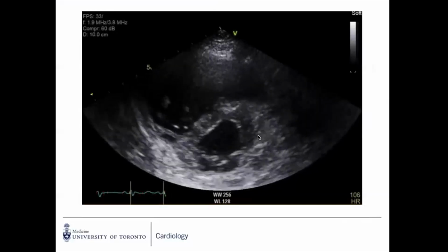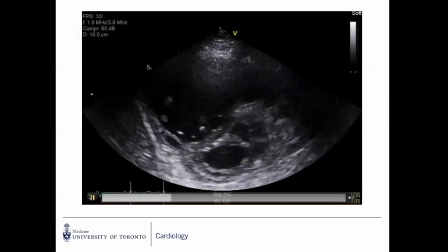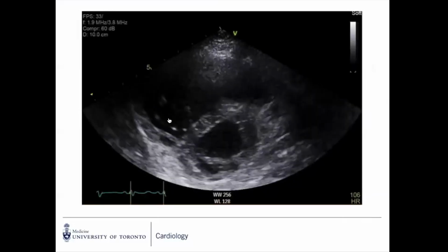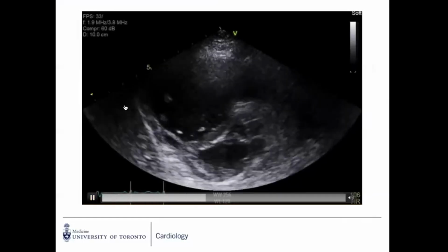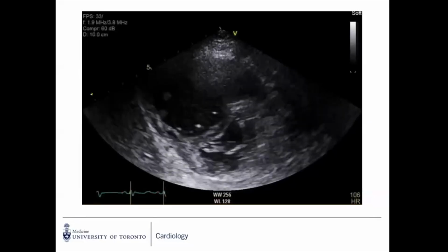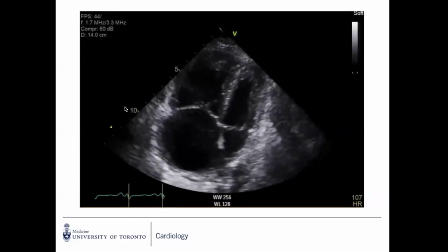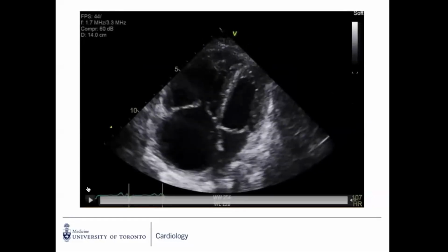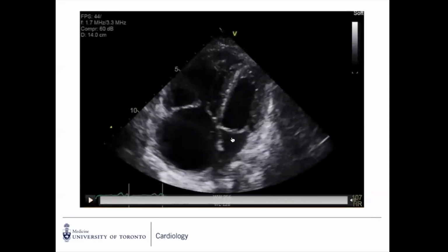So here, what do we see? D-shaped septum here. Think about the crescent tear shape of the RV here, significantly enlarged compared to the LV. And then this view here, a little bit off axis, but we're able to see our RA, RV. You can see compared to the LV significantly enlarged. And so this would be a reasonable place to get our RV basal diameter in mid.